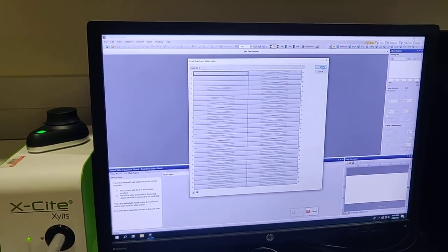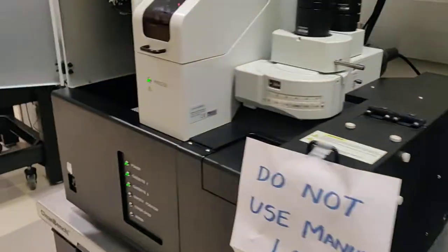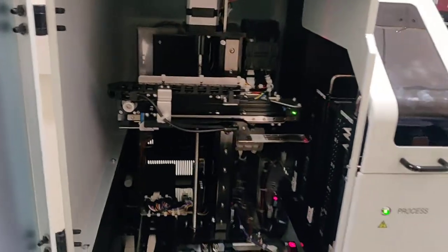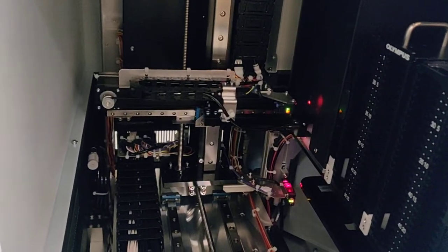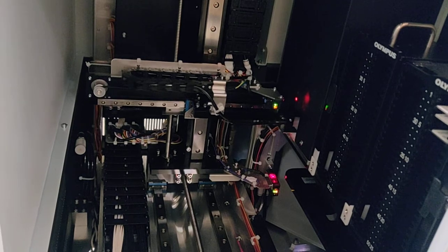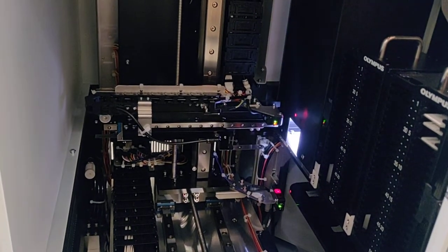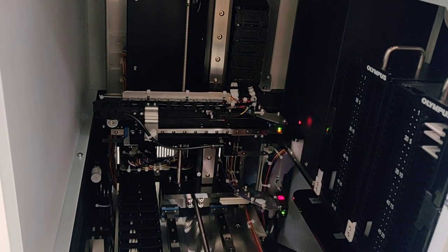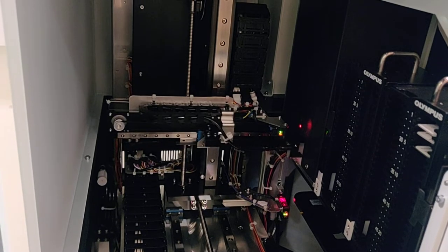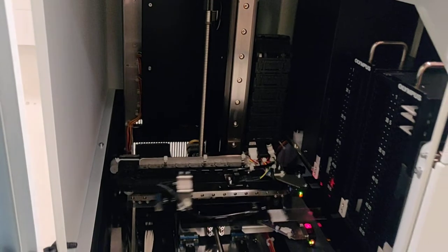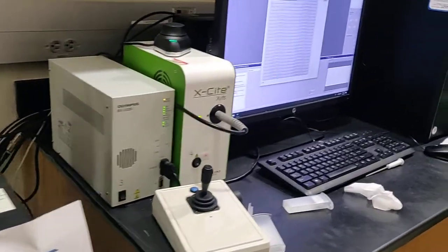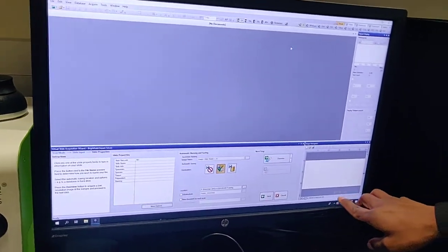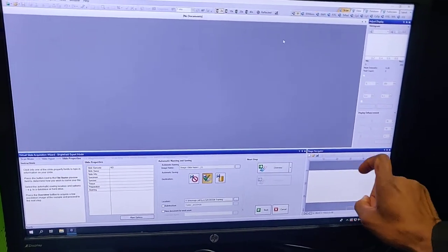For now I will pick this one and say OK. It is going to go and pick the slide. It picks the slide like that. Now it will take it to that hole. It will take two pictures. One picture will be a normal white image, and then it will do a barcode scanning with the red color. Now it takes it and places it on the stage. Currently the objective is parked somewhere here. This whole field is the slide area.